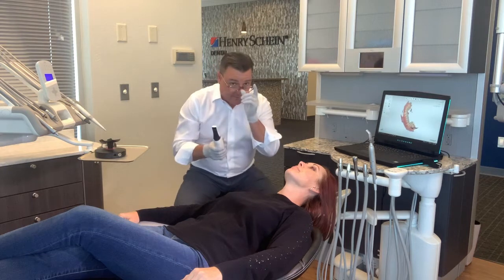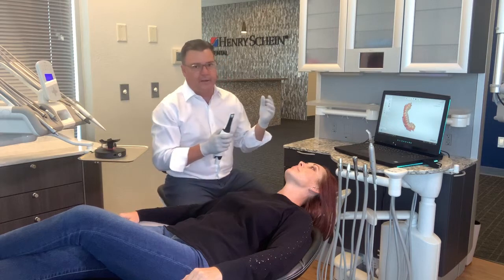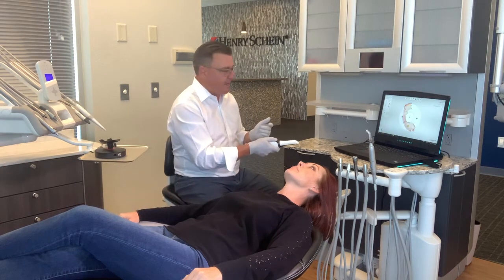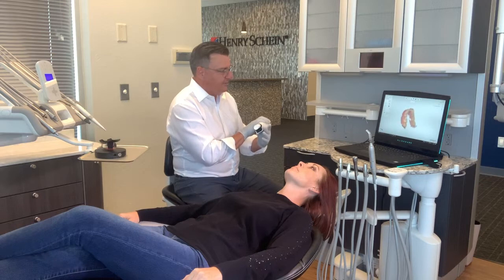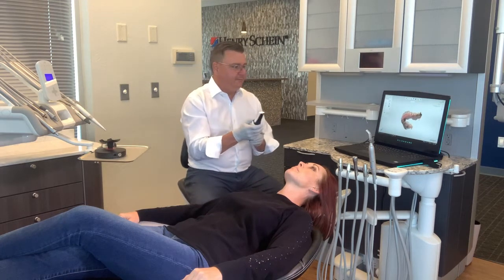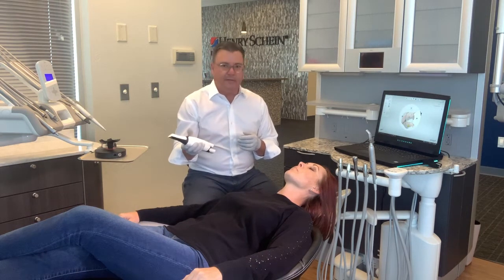One of the innovations in the scanner that are very convenient is now I need to identify if I'm missing any parts of the scan. By simply clicking the button of the scanner and pointing it up, I can now rotate around using the scanner as kind of a joystick. When you're happy with the scan, all you have to do is click one more time and then we can move on.